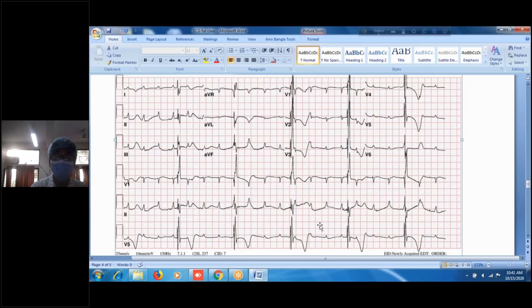And when you get an ECG of complete heart block, you try to make a search for inferior MI. Sometimes inferior MI is a common cause. We go for the inferior leads, 2, 3, and there is no Q there. No ST elevation here in 2, 3. In your exam, usually you are tested with a simple one, and the detailed findings are usually not given. But in your clinical practice, you should make a note of that. So this is the ECG of the complete heart block.